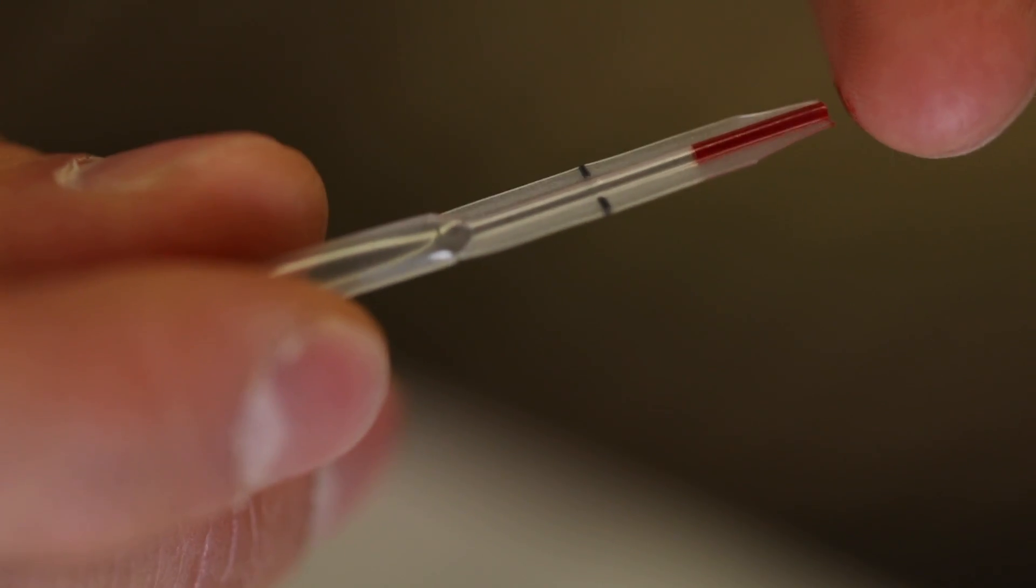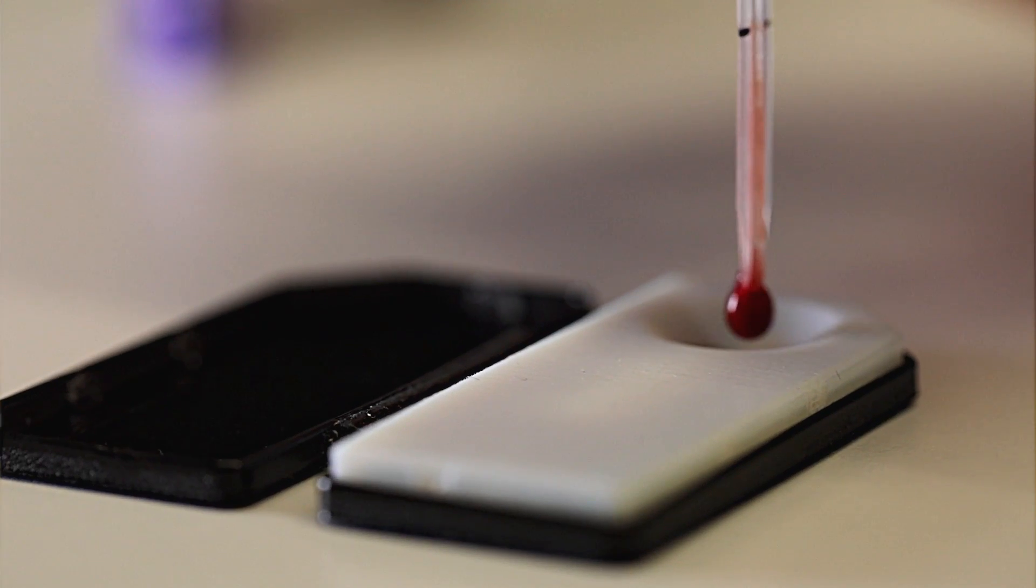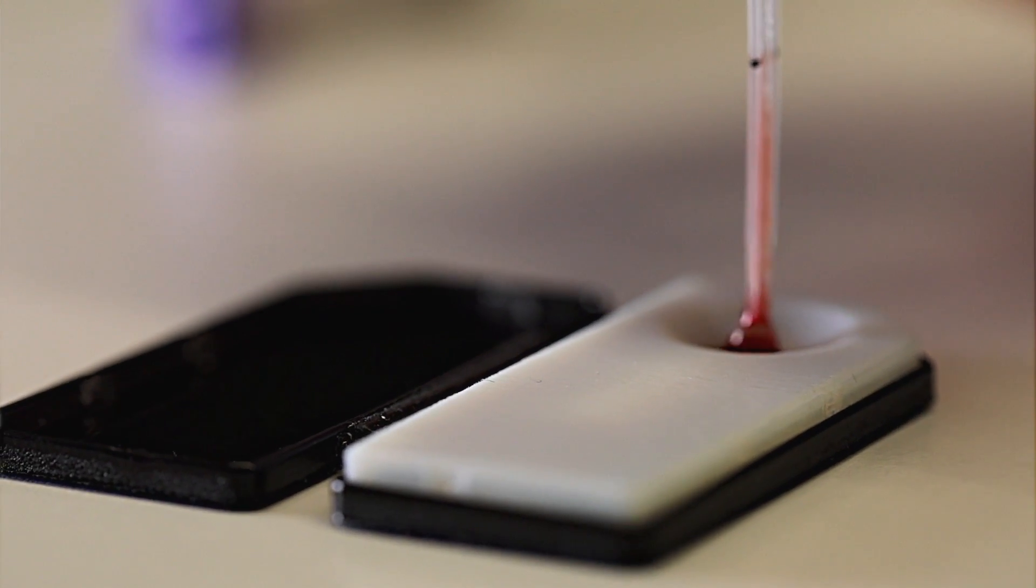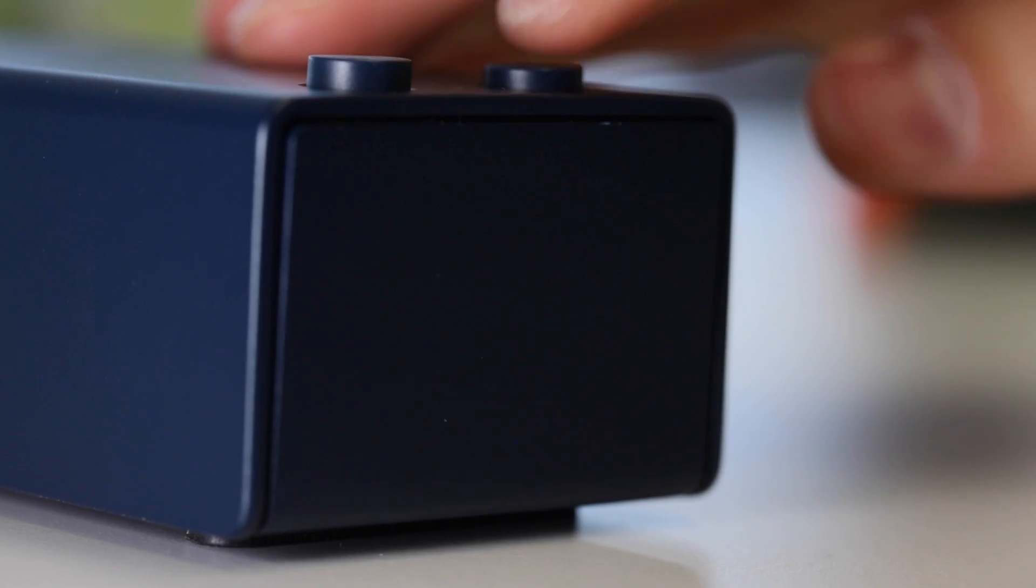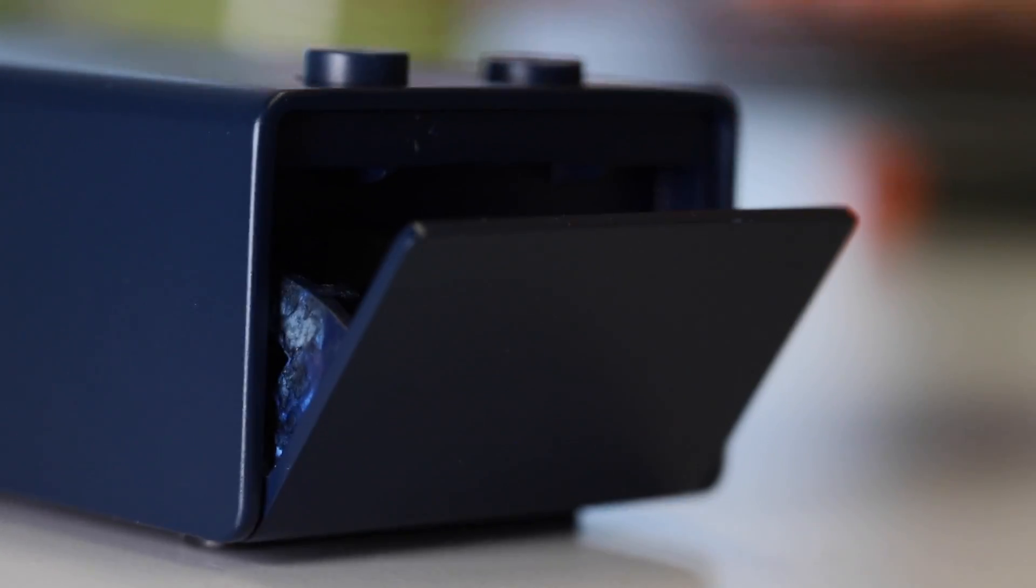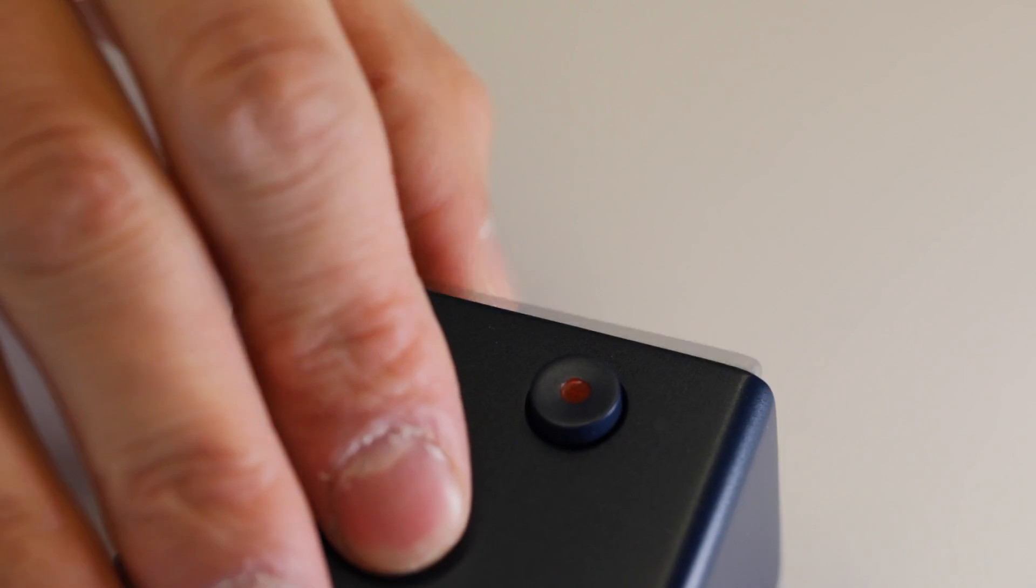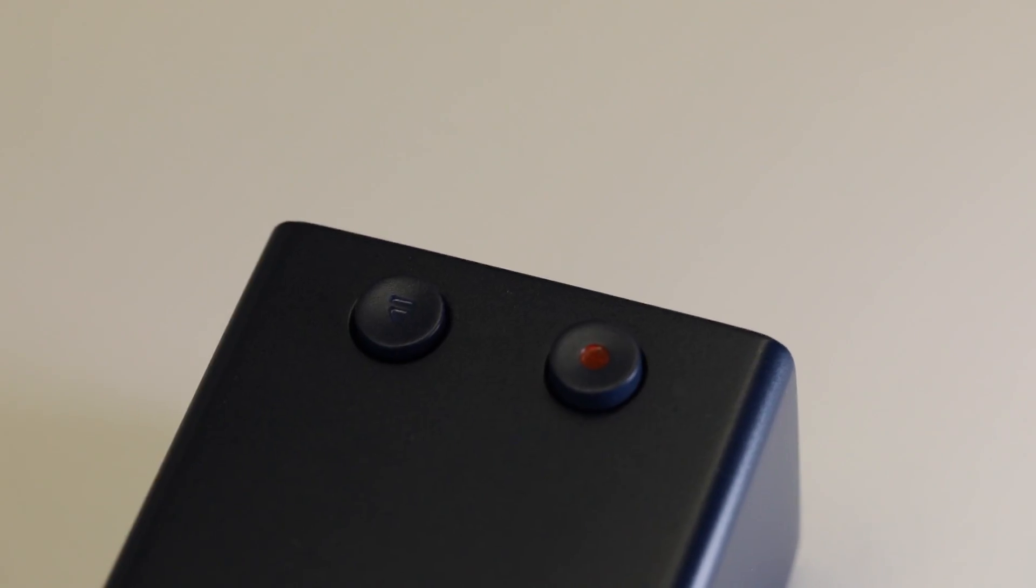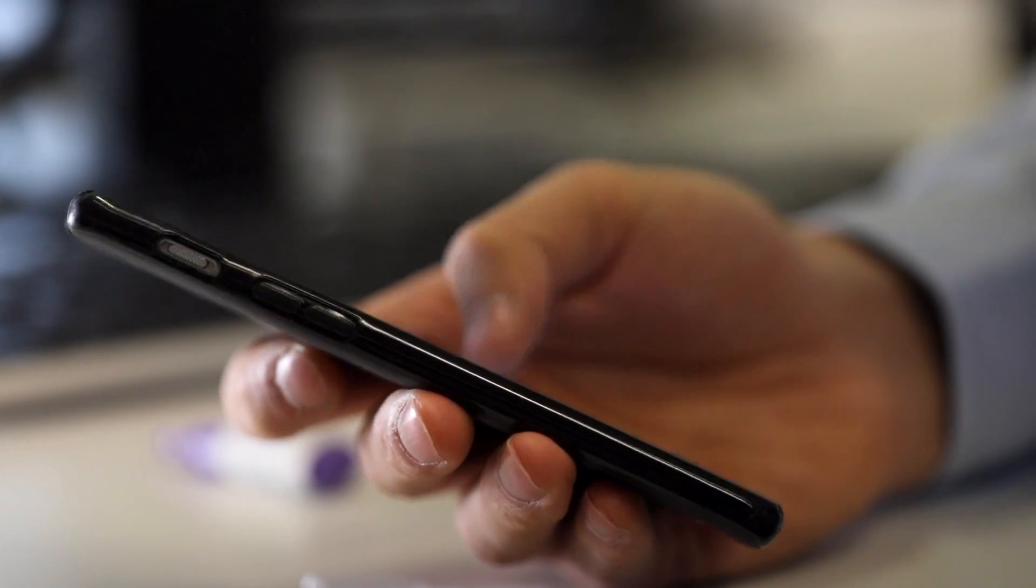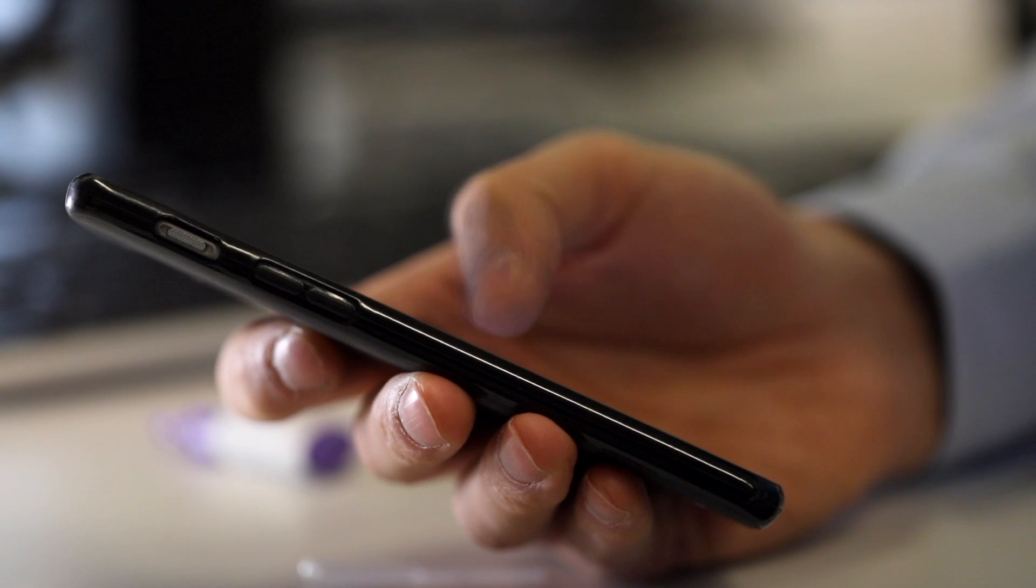The patient will have a simple portable handheld device. He will just put a drop of blood on a test strip, put the test strip into this device, and then the device is connected to his phone by Bluetooth and he will get a result on his phone.